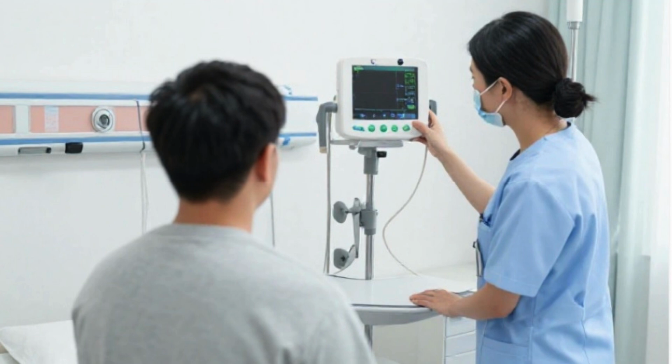9. What information can trend graphs provide? A. Instant diagnosis. B. Changes in vital signs over time. C. Battery status only. D. Alarm volume levels. 10. What is the main function of the alarm system? A. To store patient data. B. To improve image resolution. C. To alert staff to abnormal vital signs. D. To control sensor placement.